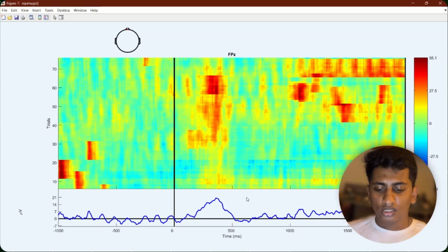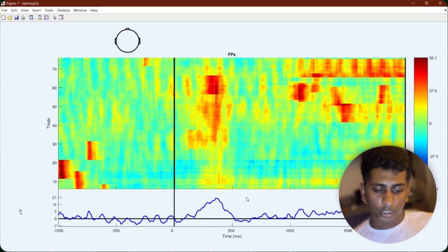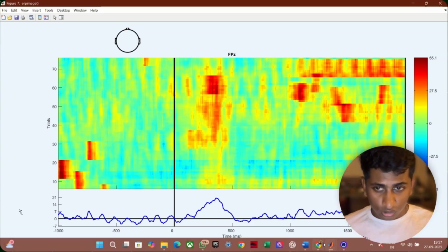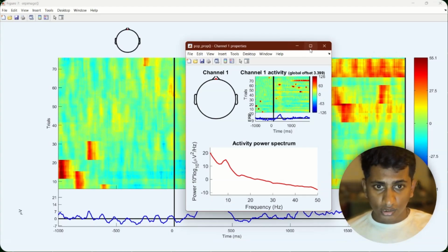In the ERP studies, it will be like plus or minus 100 microvolts, acceptable for MI. The joint probability outlier threshold is around 3.0 standard deviations. It has downsampling if necessary. So you can see this.